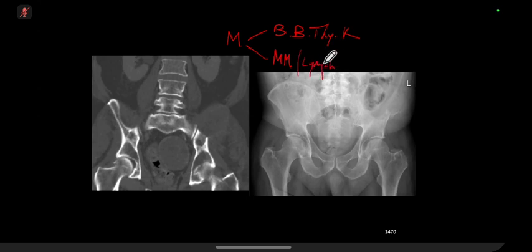All of these causes will comprise 95% of the causes of this destructive lesion. So don't go talking about uncommon things like melanoma, colon, ovary, and then things that don't cause lytic metastases. Just think about those 4 metastases and then myeloma and lymphoma. And look for other lesions elsewhere when you're describing it to the examiner.